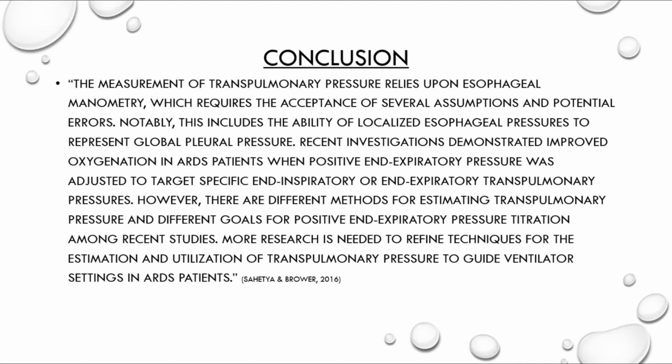After we make changes and the patients get better, we can take new readings and then further adjust our vent changes. There's definitely more research that needs to be done to refine these techniques and guide our ventilator changes. And that's it.